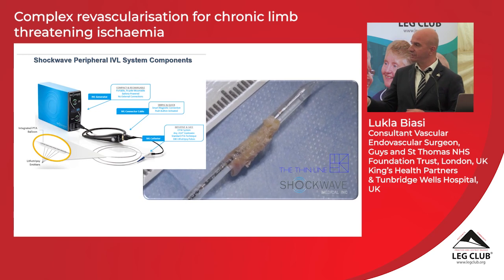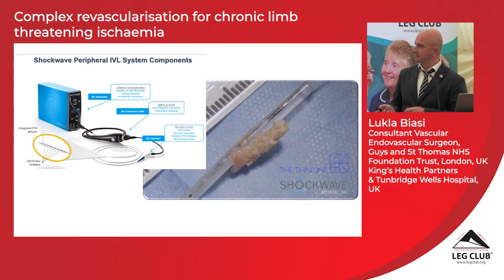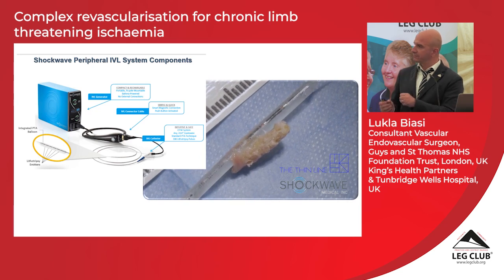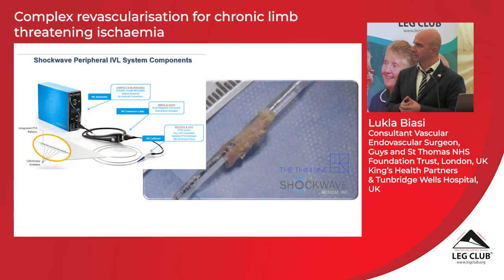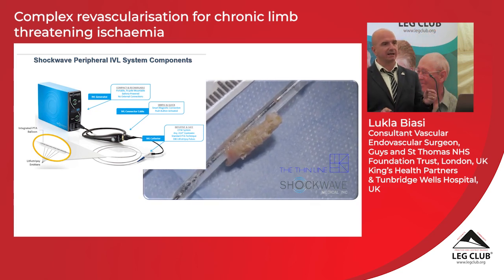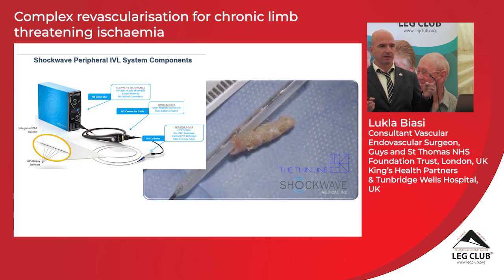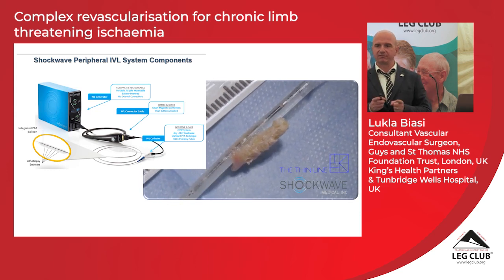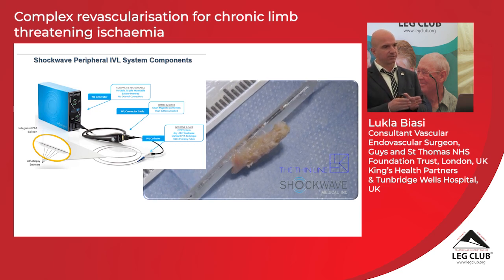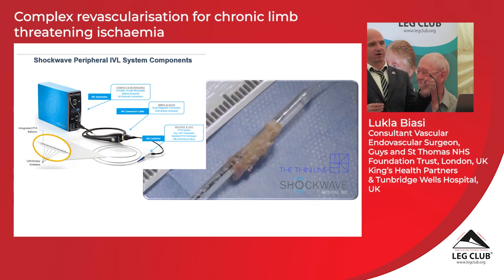Look what happens in vitro. Okay, this is a piece of calcium, a calcified plaque, and every sonic wave tends to break down the calcifications. It's very, very powerful. Again, like everything in technology, there is never one solution for all. The key is to use a technology for your specific patient. The indication is the key. In the same way you use dressings, there's not one dressing for everything.